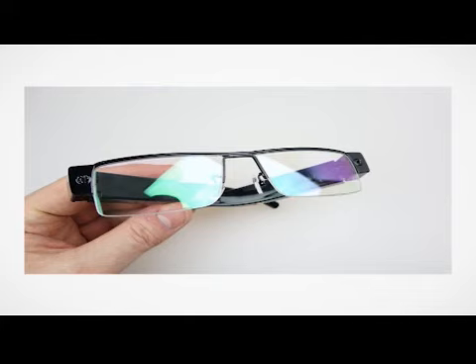Portable electronic image magnifiers. An eyeglass frame is one that has a miniature video camera attached. It is used for enhanced vision. The camera has a zoom lens which the user can control and has autofocus, so the images are always sharp. One or both lenses of the eyeglasses serve for both regular direct vision and video enhanced vision. The higher the magnification, the smaller the field of view and the shorter the working distance.